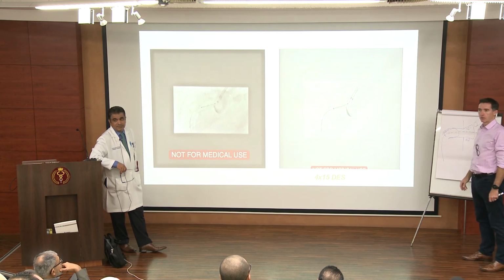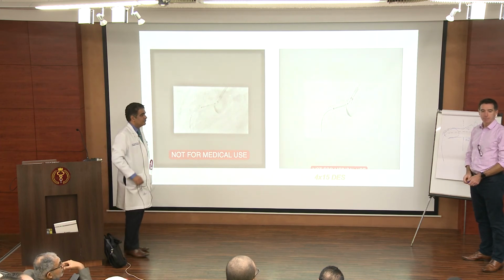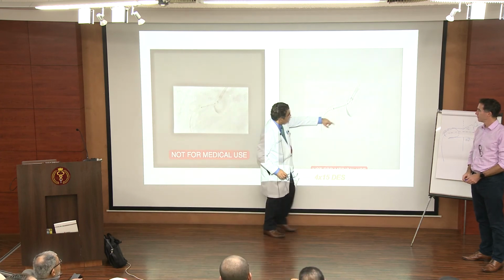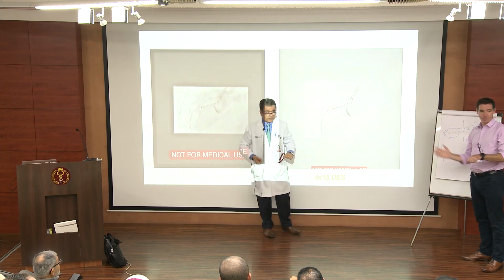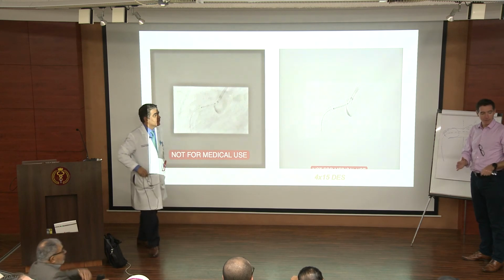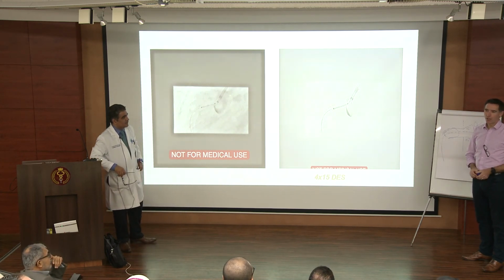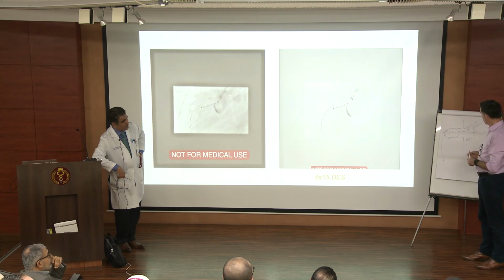From one side. All sides. And the balloon is inflated inside the stent. So the balloon is inflated in here, and you just keep on pulling and pushing. So you rotate the guide to make sure everything is pushed down, hit it again, and then rotate it. Damaging the stent's not the issue. Once you hit it a few times, what you have to do on the way out is to reinflate.